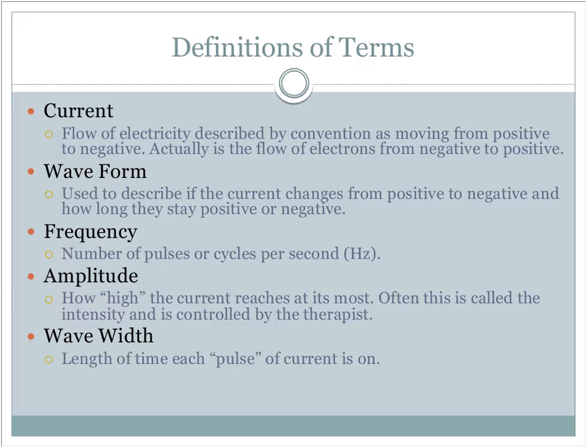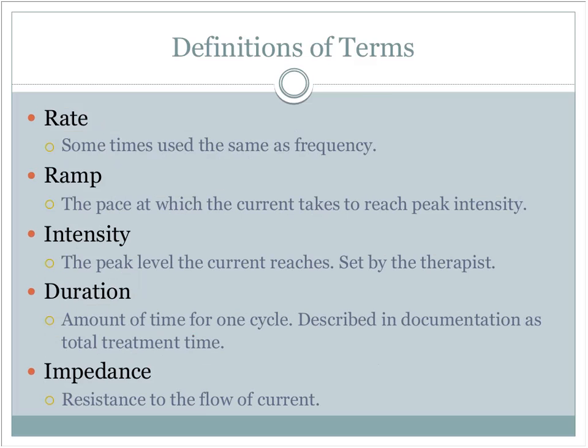And say the frequency of your wave is 10, so 10 hertz, which would be 10 waves within a second. And if we said a second was divided up into 100 units, then each width would be 10. So each wave width is 10, and you have 10 waves in that cycle. So 10 times 10 is 100. Trying to do the math easy so I don't get lost.